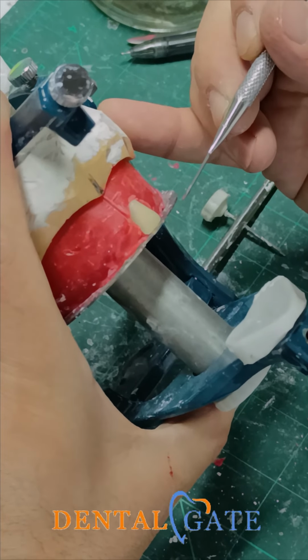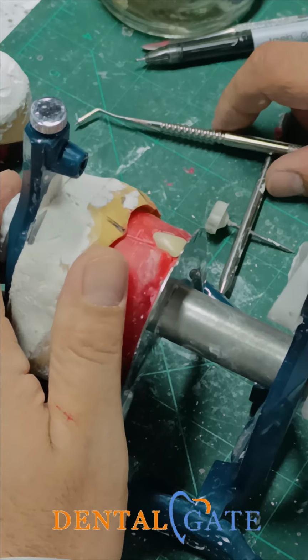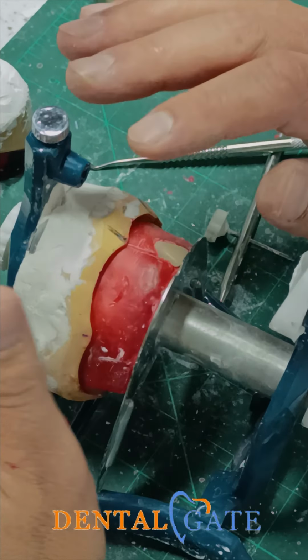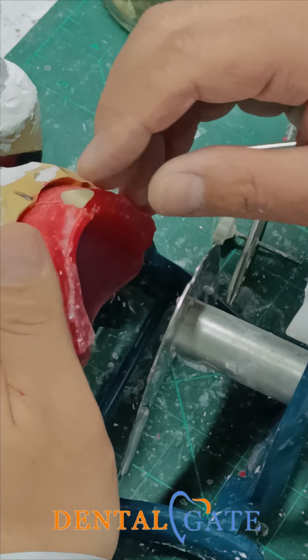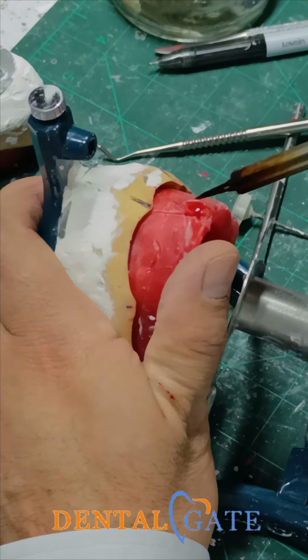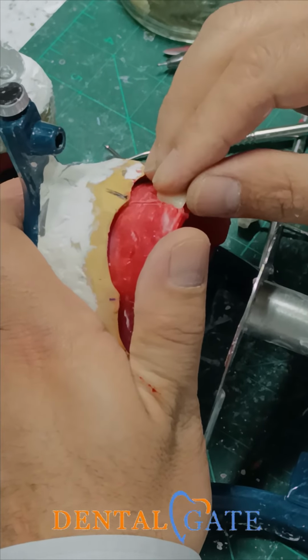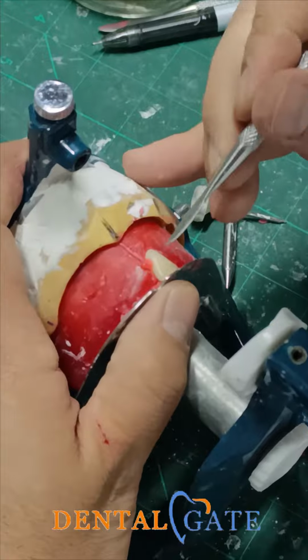If we had a patient with class 3, you can make it within the level. But the ideal one, we will start with these criteria. We can alter these criteria if we need to, okay? So you can now remold the wax again to ensure that the central incisor attaches to the table in the perfect position and the midline is preserved.